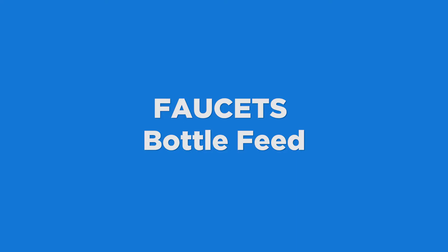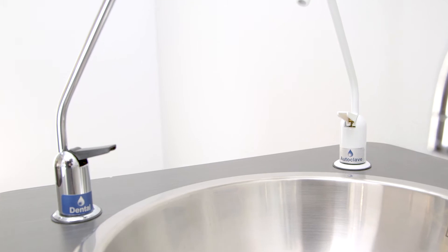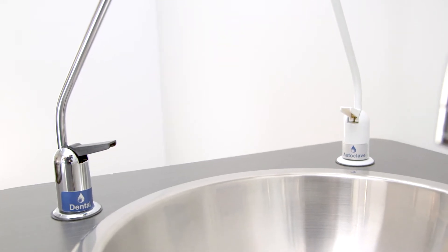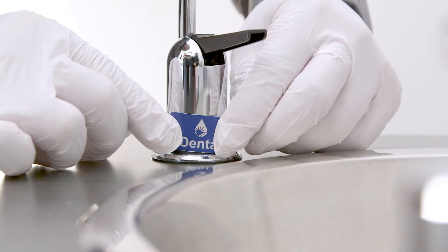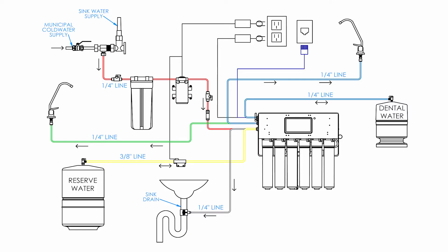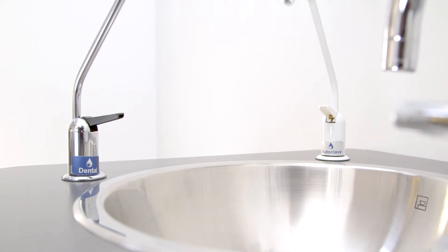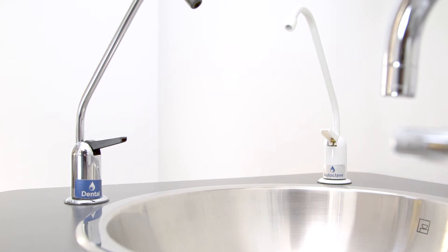Faucets. The bottle fill configuration includes a white autoclave faucet and a chrome dental water faucet. Dental water is always plumbed to the chrome faucet. The faucet can be mounted on a countertop or on a wall using an optional remote mounting bracket. For the purposes of this demonstration, we'll go over countertop mounting.